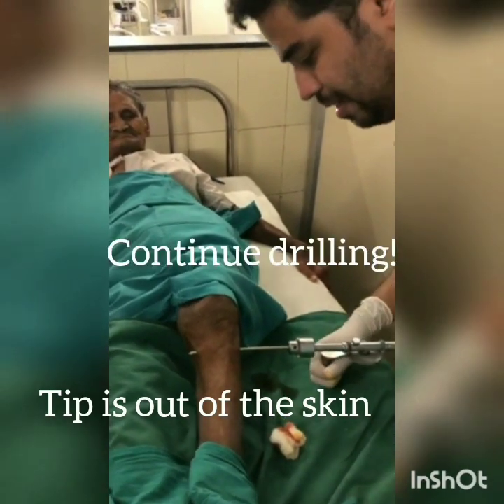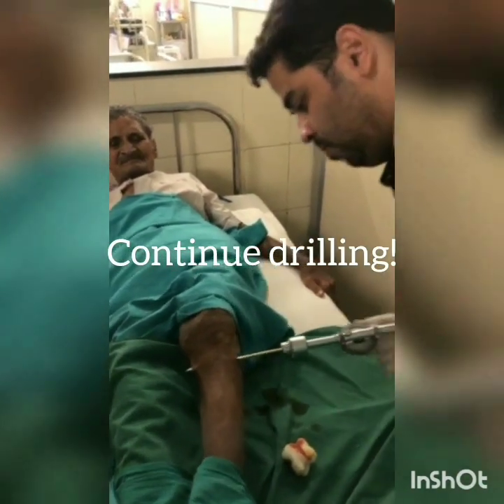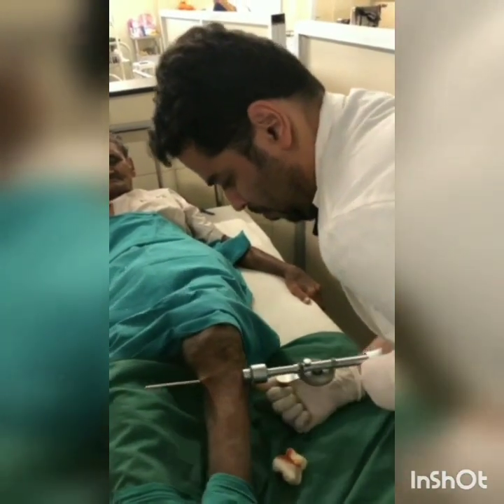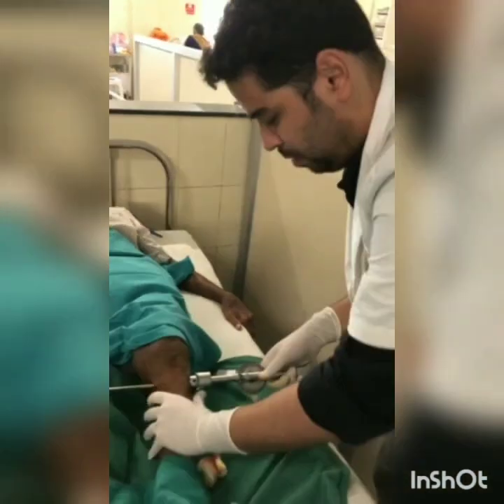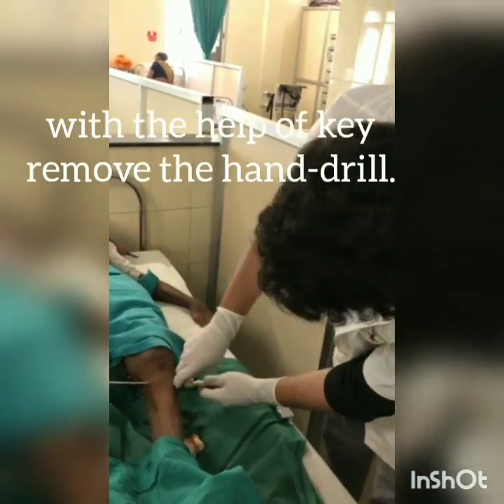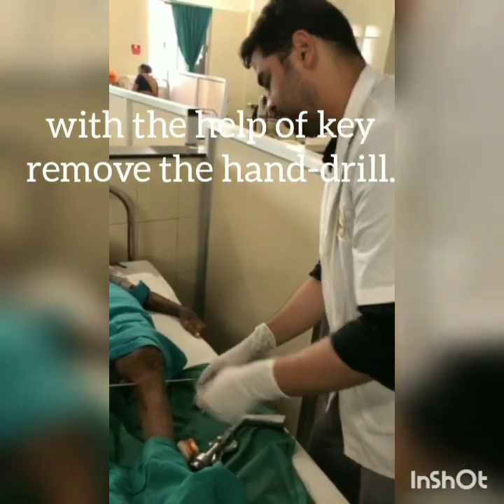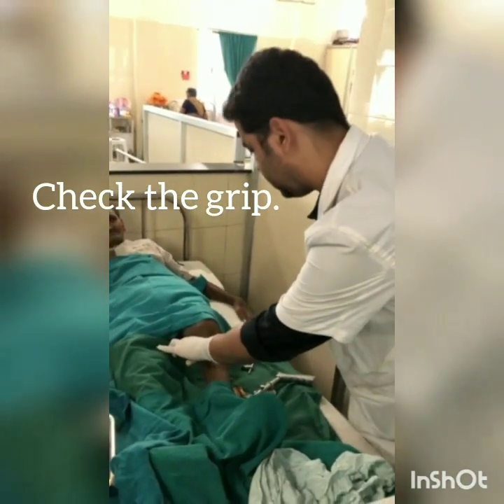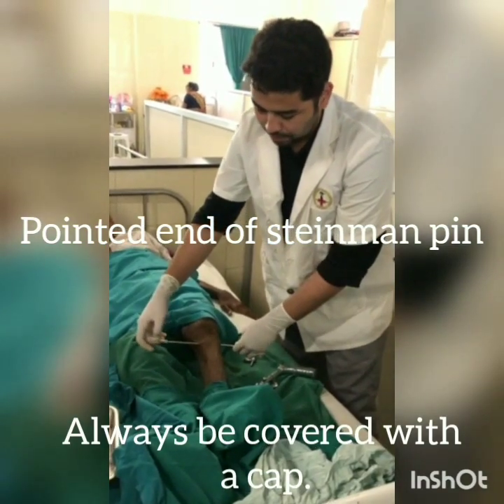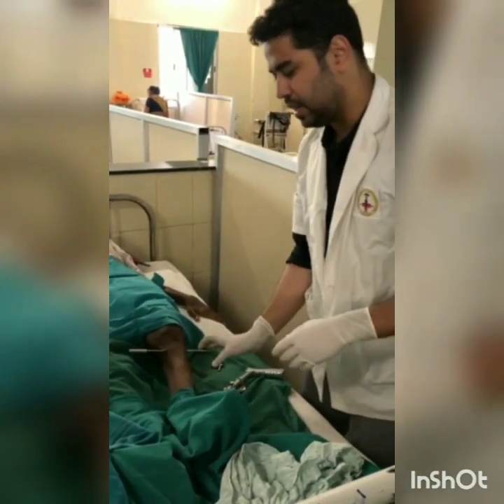Once the tip is out of the skin, we have to continue to drill. We should be careful to protect the opposite limb. Now we will check the grip. The blade end of the Steinmann pin should always be covered with a cap, and pin site dressing is to be done.